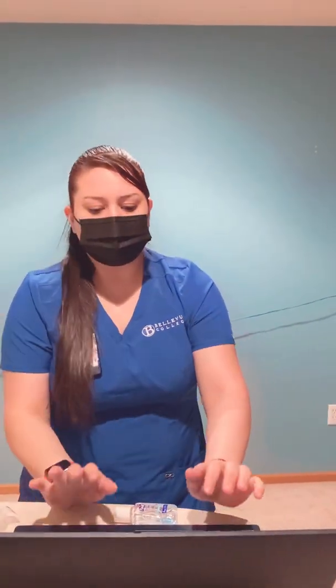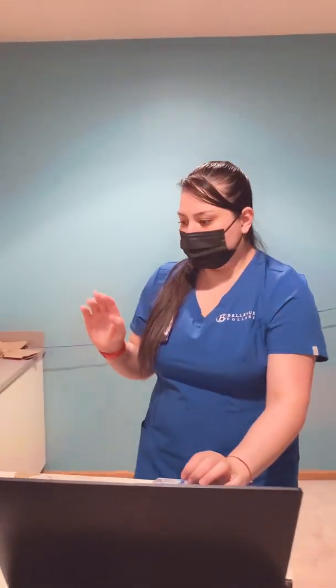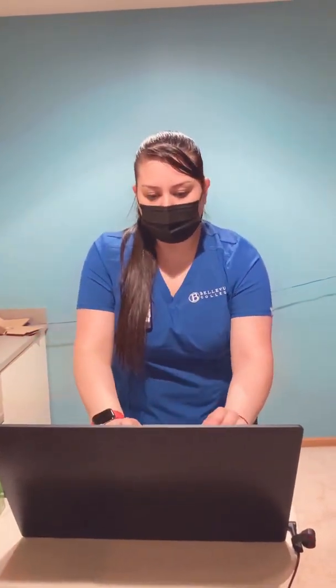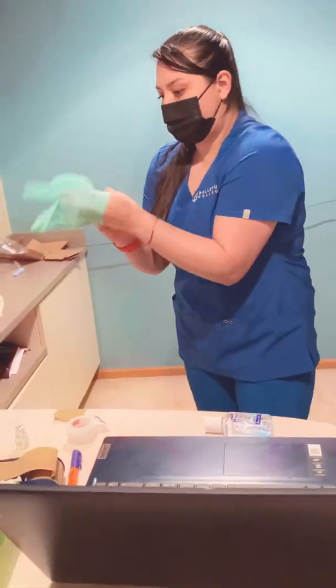And now I'm going to administer the cefazolin that will be infused with the 0.9% sodium chloride for the patient's urinary tract. And the dose is 500 milligrams to be given every 8 hours. And the route is IV piggyback. The time is to give now. And I need to give it over 15 minutes. Okay? So I'm going to then put my gloves on.